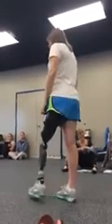All right, so do you mind walking back and forth a couple times? Click in there for a second. Is that you in the socket? That's good. Couple more times. One more. I'll say one more about 10 more times.